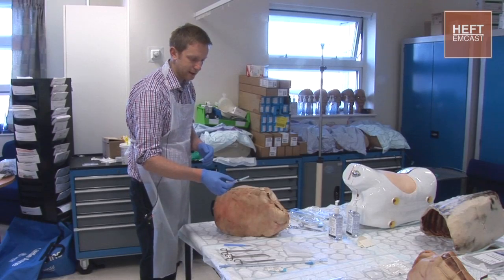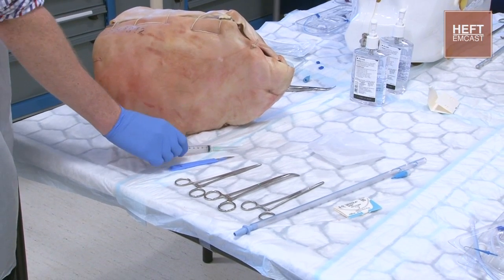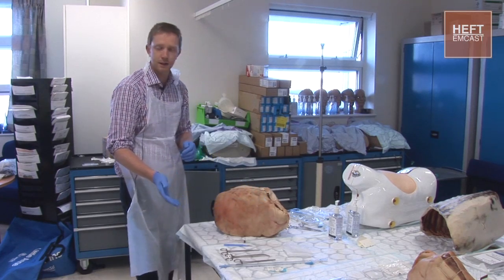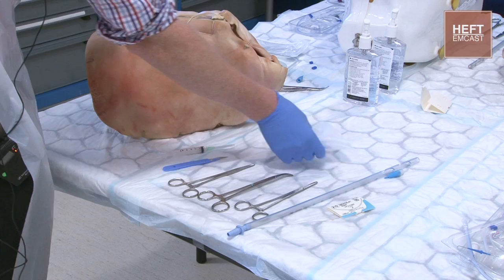To start off with, we're going to need some local anaesthetic — some lignocaine in a syringe with a needle on the end of it. It's probably going to need to be a bigger syringe than a 5ml. Then we're going to need some chloroprep or something to clean the skin with.